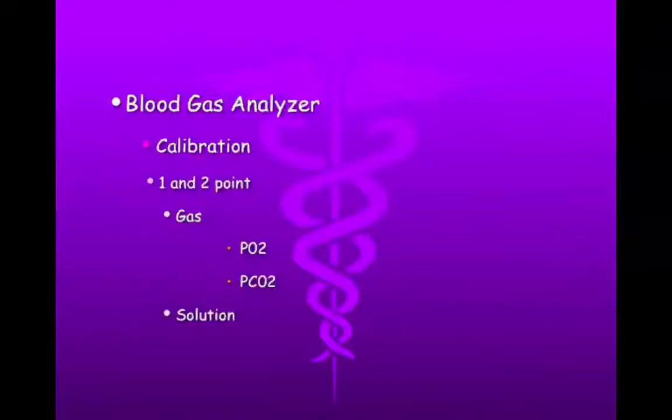Okay, we talked about blood gas analyzers. We do 1 and 2 point calibrations. We use PO2 and CO2. We also have electrolyte solutions. We have controls that will have a pH that is a certain thing, and a CO2 that should be a certain thing, a PO2 that should be a certain thing.